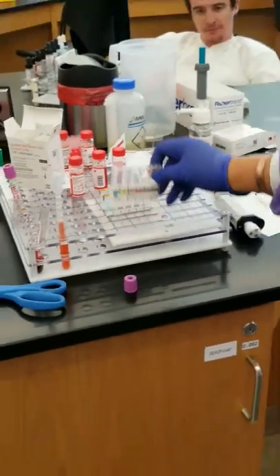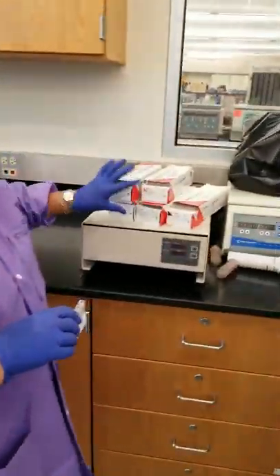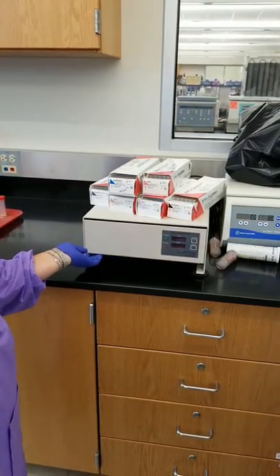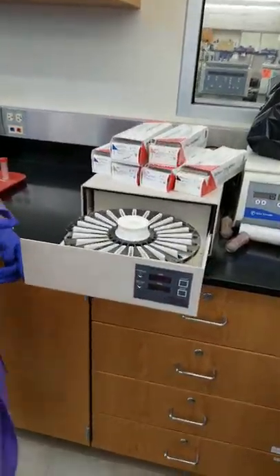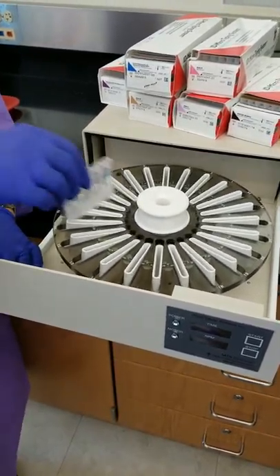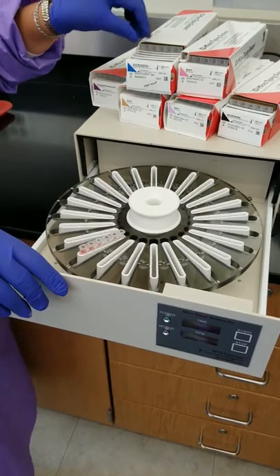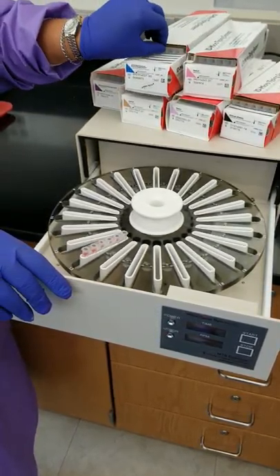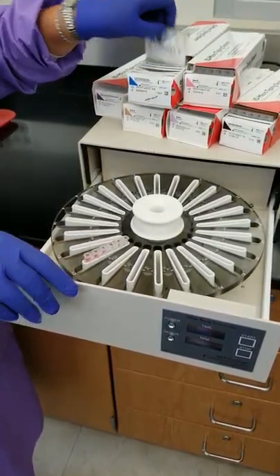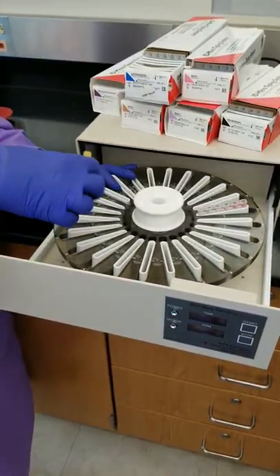So what I'm going to do with this is I'm going to come over here. This is the centrifuge that goes with the gel workstation. And if you look, it has little slots in it, just like it has little slots in the incubator. So I'm going to put this in. And I'm going to have to suck it up and use a balance because I can't spin just one. Sort of a potato chip, right? So put this in.